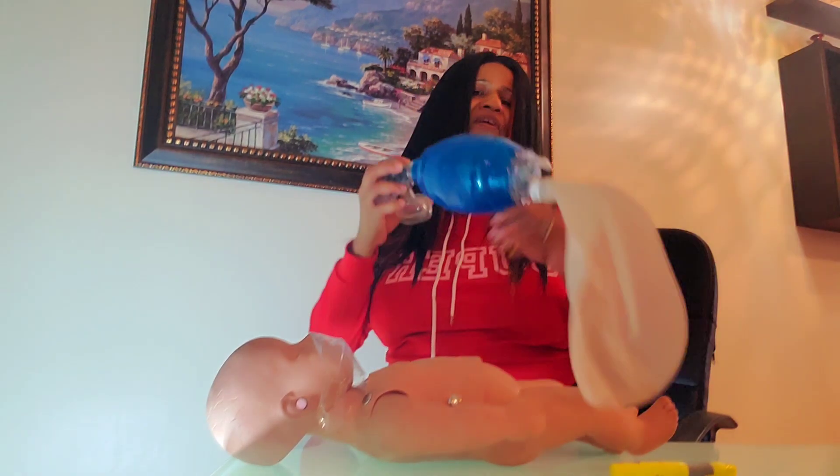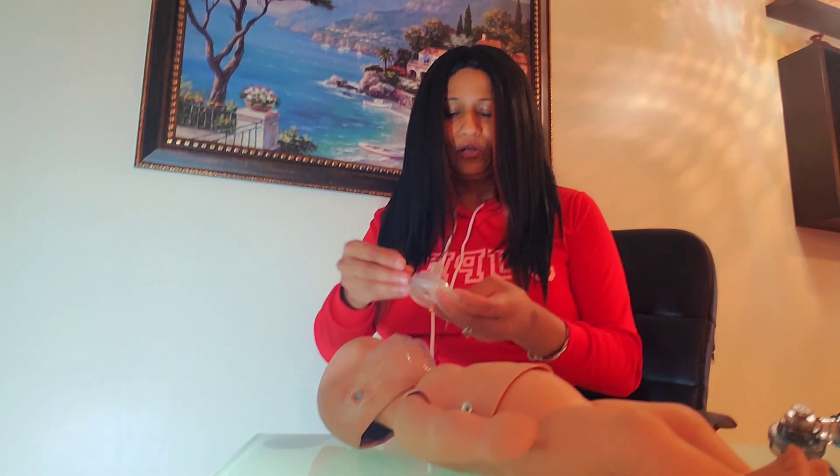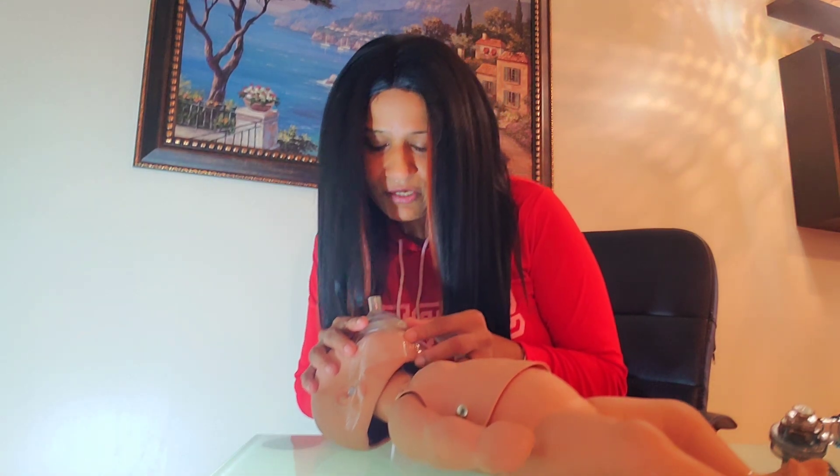This is your ambu bag. You can either use an ambu bag or a pocket mask. You place the pocket mask on the infant's face, compress it, and give two breaths. The ratio is 30 compressions and two breaths for five cycles.